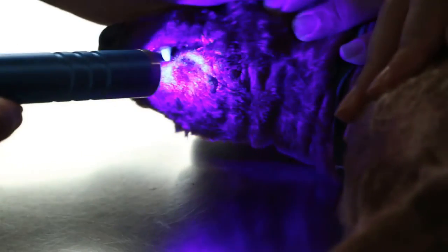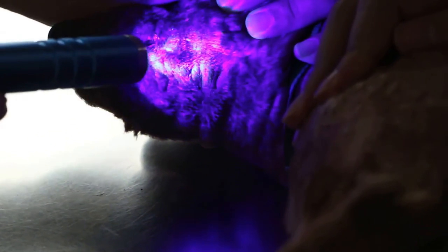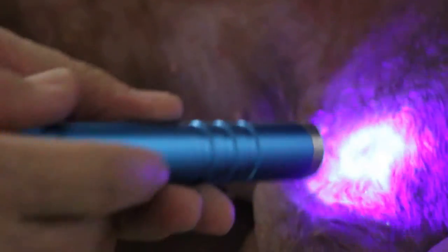And then I check the muzzle. The muzzle — no contact because it's all wet. But this is definitely ringworm. It's a clear case of ringworm all over the body. Let me check this one — this is also wet. You can see the fluorescence, all the shining spots. This is ringworm.